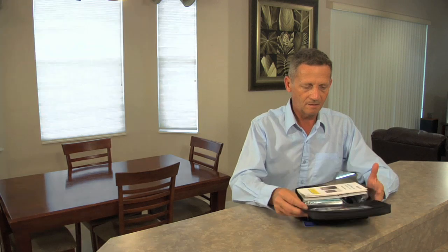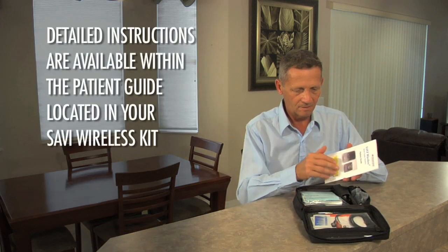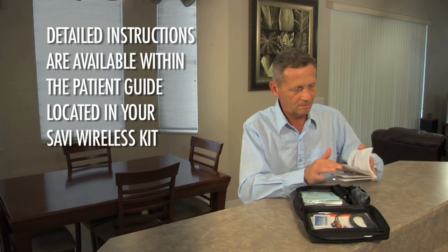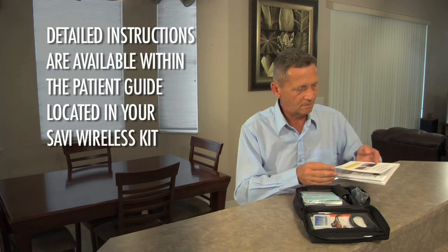Please note, this information as well as more detailed instructions is also available in the patient guide located in your Savvy Wireless kit. We recommend you review the patient guide.